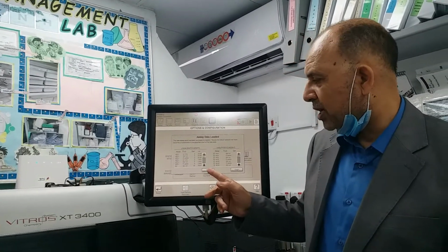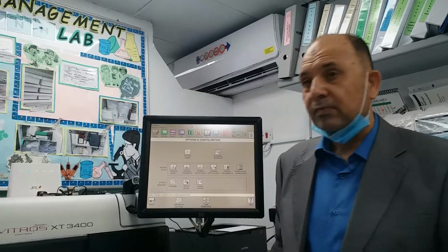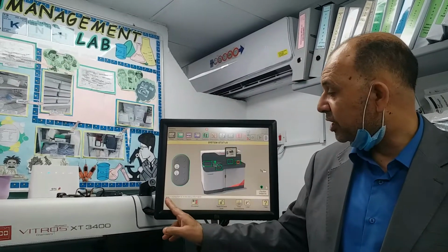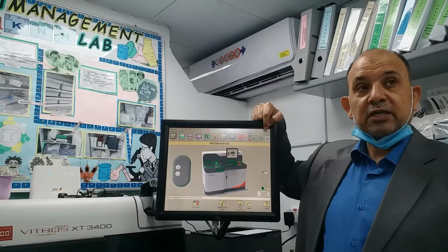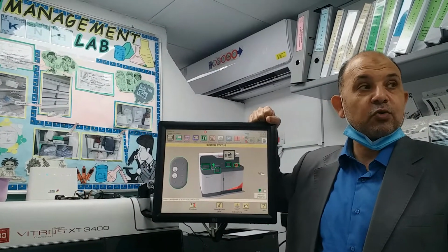Here now it says, do you like to print or do you like to finish. I like to finish. I don't like to print. Okay, so now if I check my system here, instead of 609, it's now 611. Yes, this is a new ADD now.